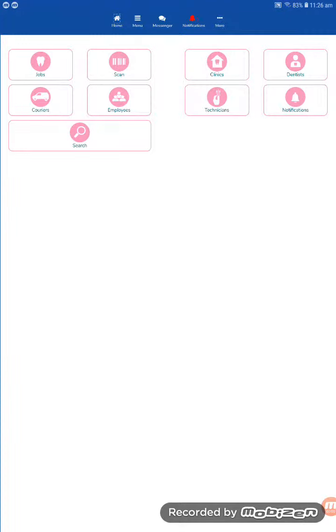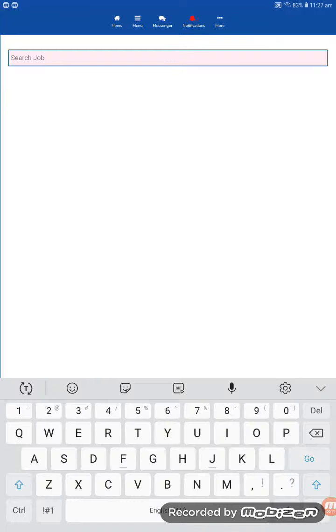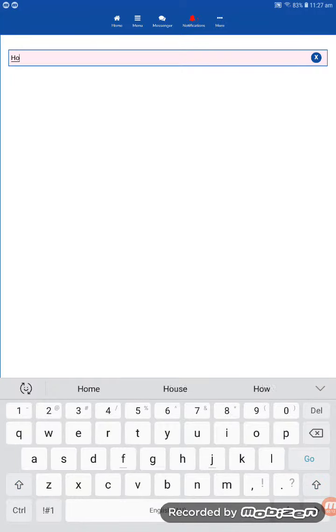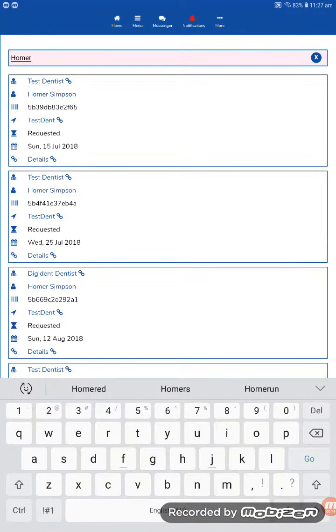One of the great features of the DigiDent Laboratory app is the ability to keep all relevant information tied together with the case. I will show you what I mean by adding an attachment to one of the jobs in the system.